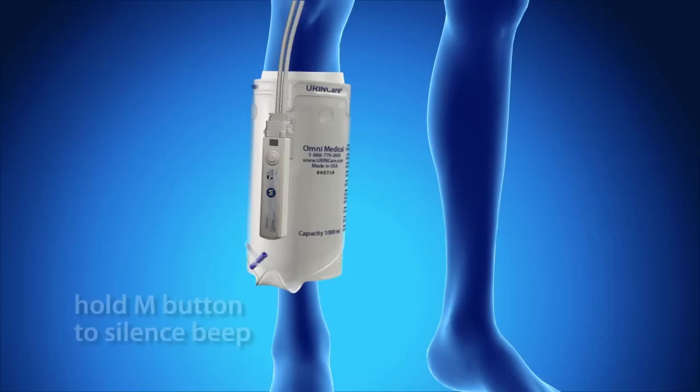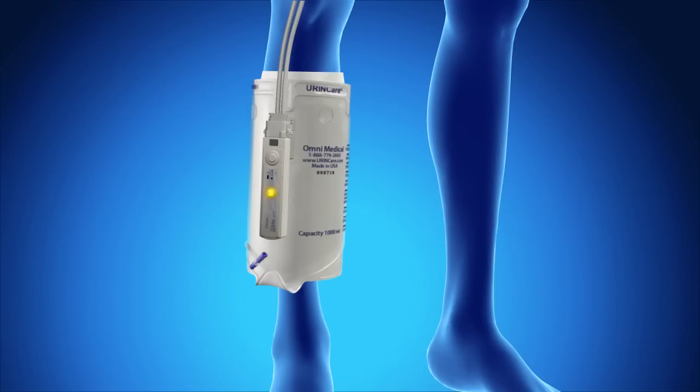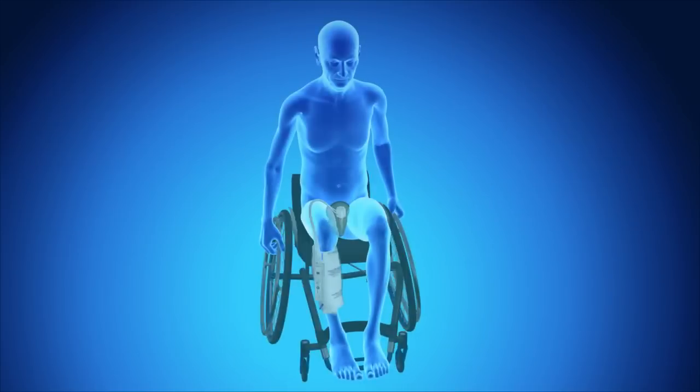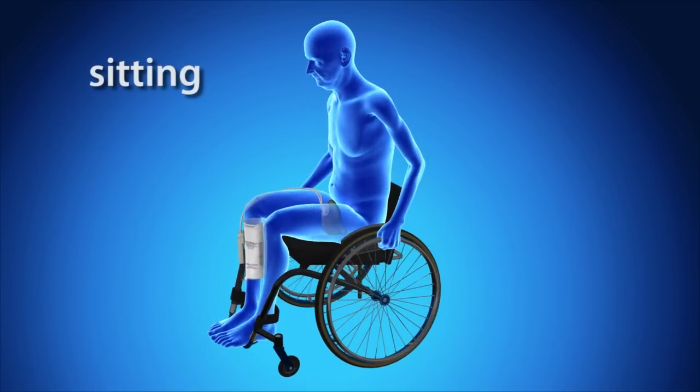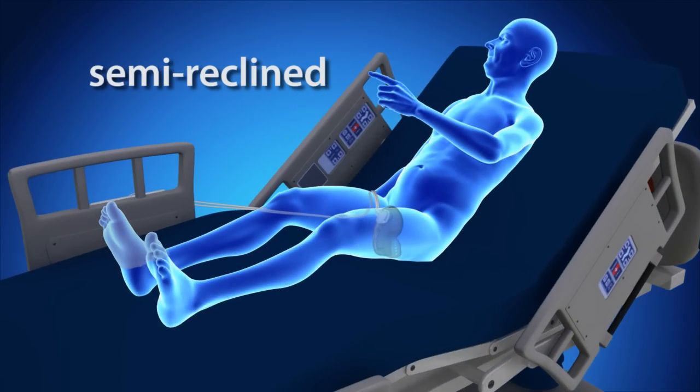To silence the beep, press and hold the M push button until the control device beeps twice. If the user continues to press the M push button, the control device will begin pumping. The urine care system can be worn while sitting, standing, walking, or semi-reclined.